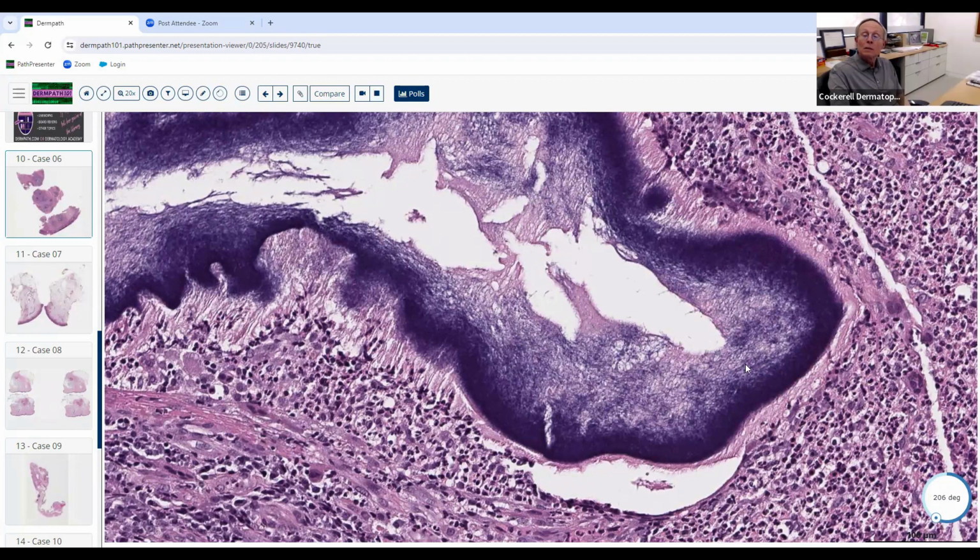You could think of Actinomyces, which has that filament. These are gram-positive rods. So this is a gram-positive rod disorder. Actinomyces is a gram-positive rod as opposed to a gram-positive coccus. Some of these little linear structures at the periphery are probably the Splendore-Hoeppli phenomenon, but they tend to give you this linear kind of morphology when it is Actinomyces.